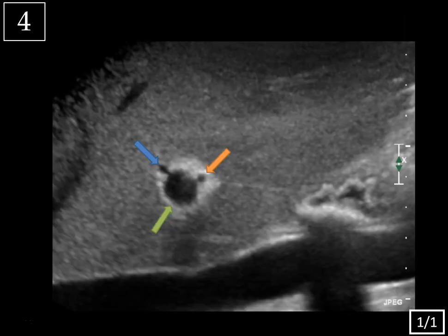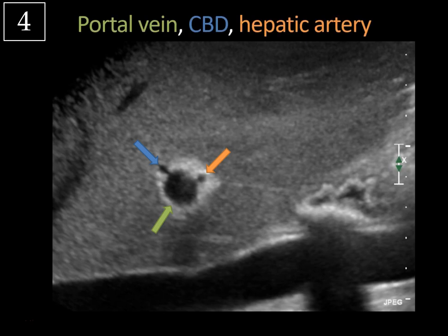Next case — a single image. What are we looking at? It's actually a sagittal view of the liver looking at the portal triad — it looks like Mickey Mouse. We have the portal vein indicated by the green arrow, the common bile duct by the blue arrow, and the hepatic artery by the orange arrow. That's the typical anatomy, surrounded by that echogenic fibrofatty connective tissue typically seen around the portal structures.